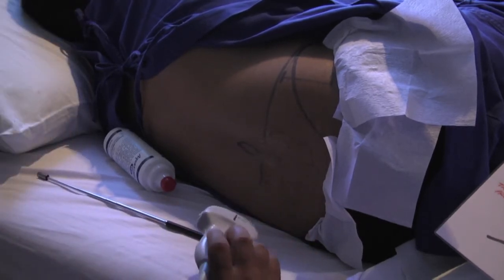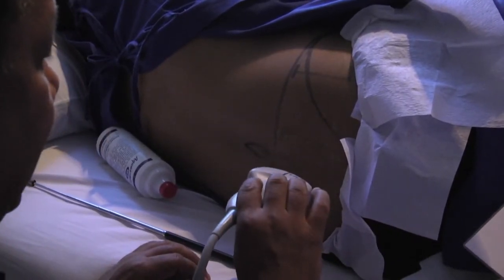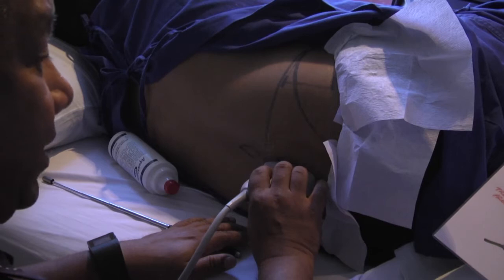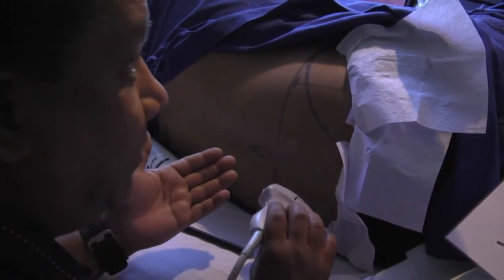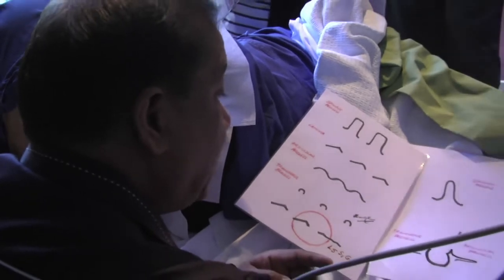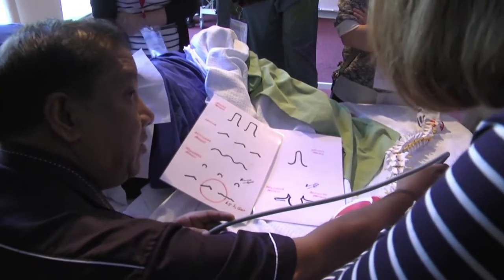This is cranial, so I'm going to place the probe now. It is a common error when you do this sagittal scan that you think you are doing the scan on the non-dependent side. This is non-dependent, this is dependent. But actually the transducer is on the dependent side, and you see structures which you really don't understand. Because when you do a sagittal scan, there is a need to tilt the probe slightly medially. And you can see here that if I tilt the probe medially, the interlaminar space is a little bit wider. Can you appreciate that? Yeah.